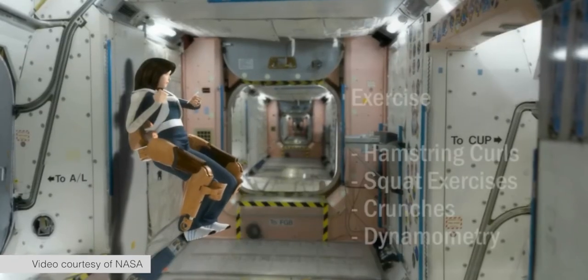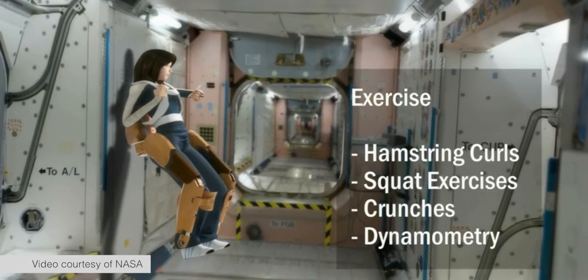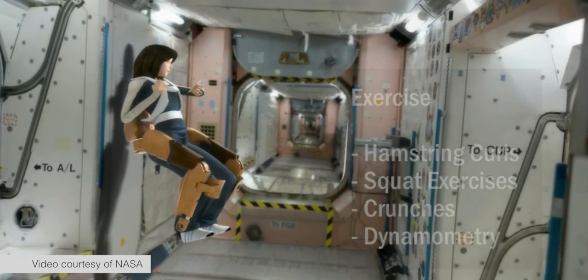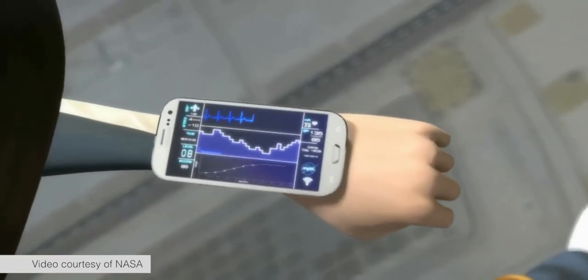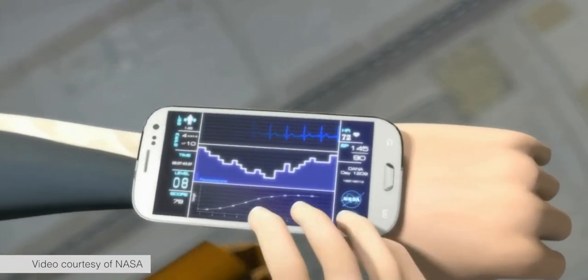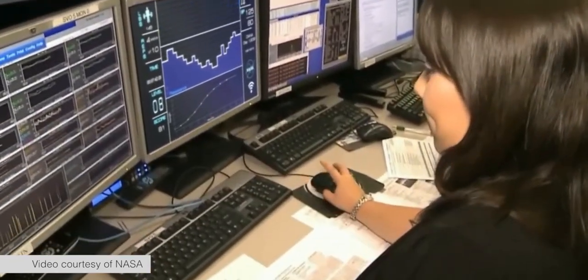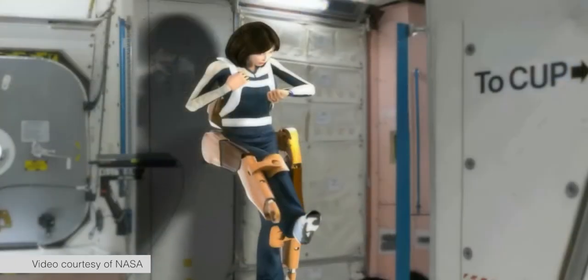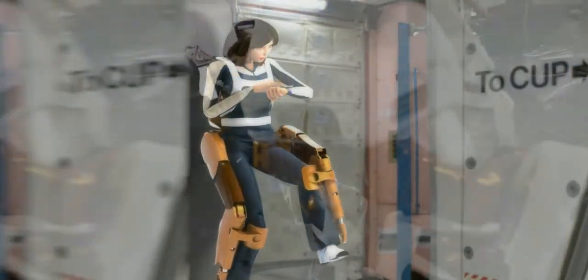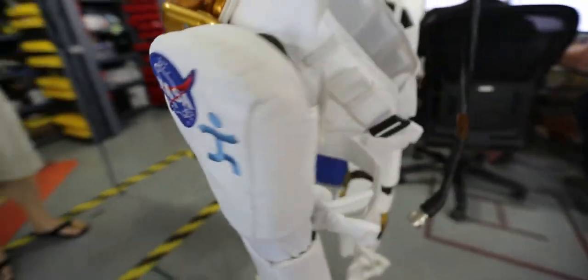You'd want to provide assistance if someone is carrying a heavy load or has weakness or paresis. NASA's interest in using this device is for a resistive or anti-assist mode — someone in a microgravity environment could put on this device and it would provide exercise or simulate gravity as a countermeasure against muscle loss and bone density loss during extended exposure to microgravity.